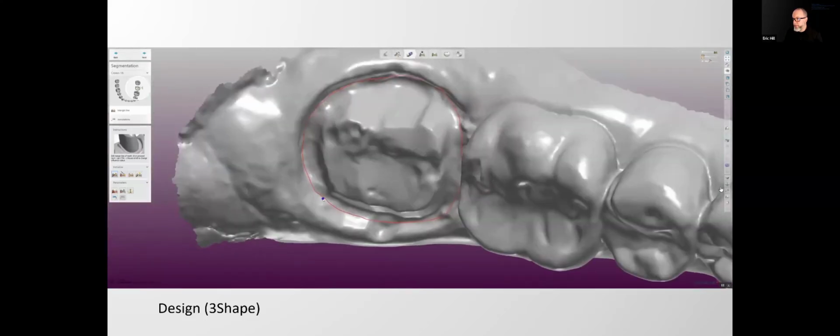Looks like I got something from Larry here. More often than not, do doctors only scan quadrant scans, opinion on quad versus full arch scans? Awesome question. So I like to look at it like this. If it's an implant case, full arch. If it is a single unit posterior, quad. Basically anything outside of a single unit posterior, I'd probably go full arch for multiple reasons.